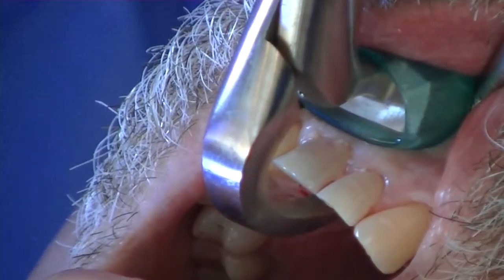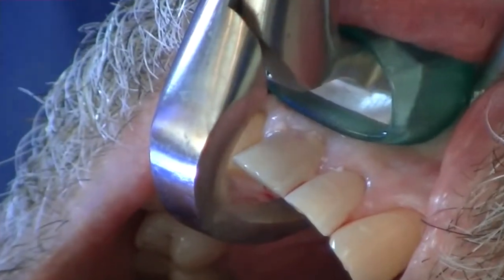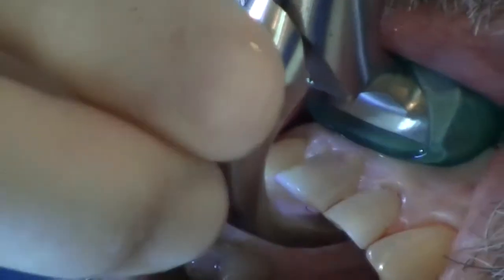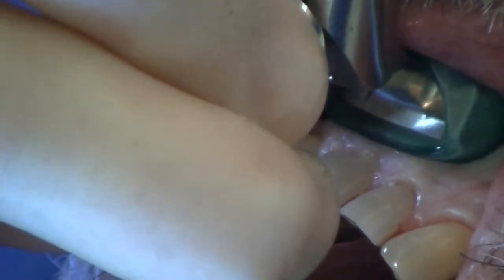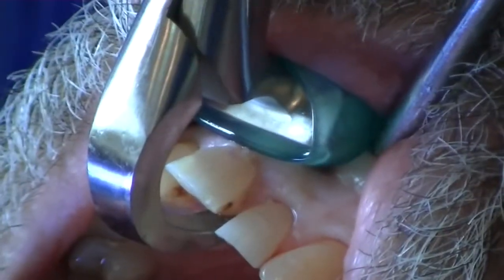And we're building up energy. I'm not squeezing. We're simply building. Just take your time. You heard it pop. Okay.